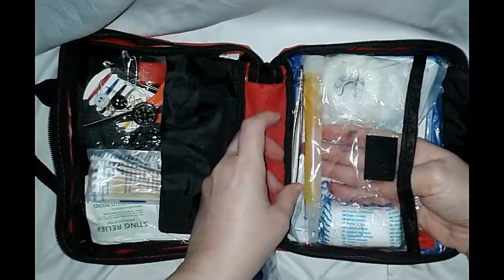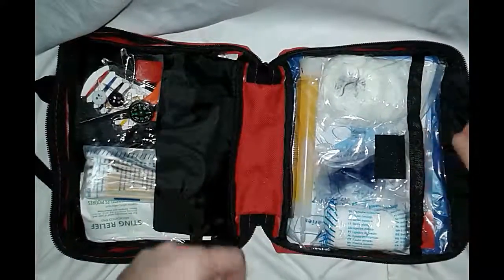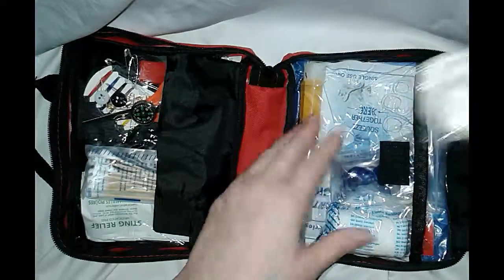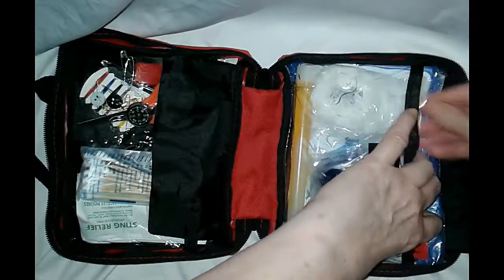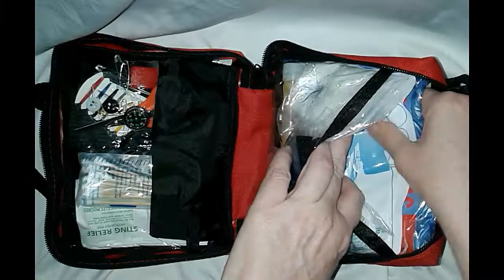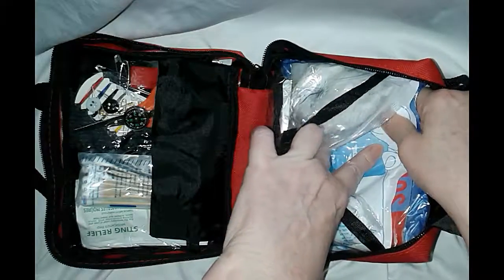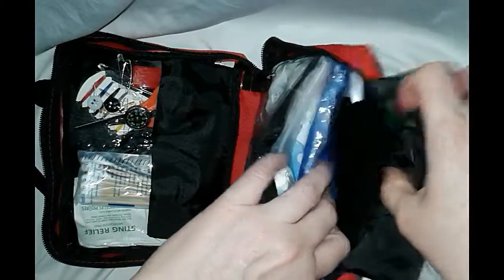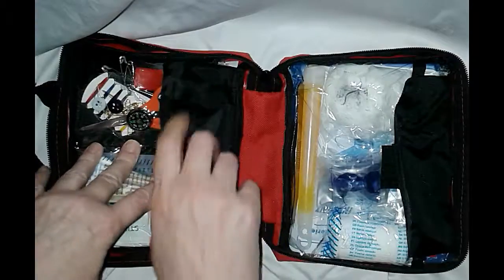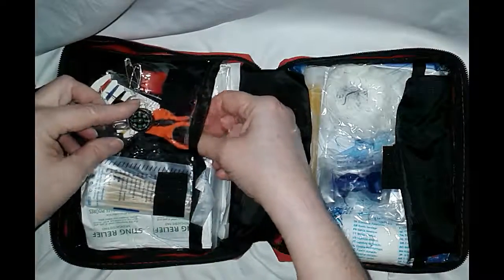It's got oversized tweezers to pull out splinters and what have you — big enough to get the job done. There are some safety gloves, a rain pouch, and a squeeze toggler. There's also a signal light: you snap it in two and it lights up.